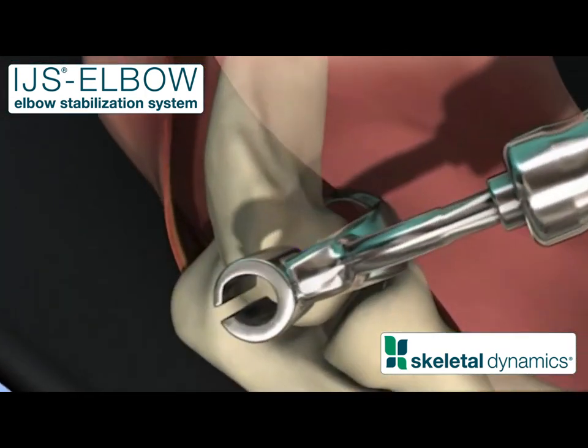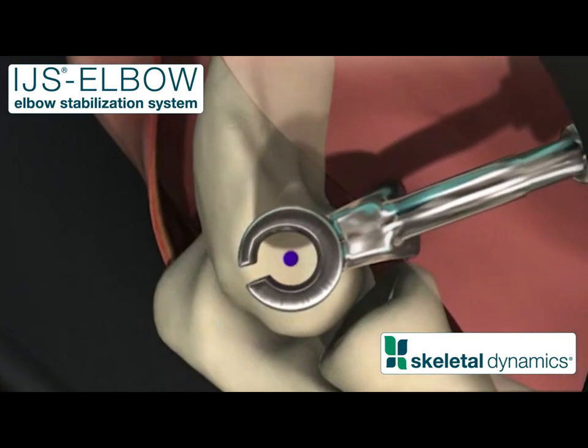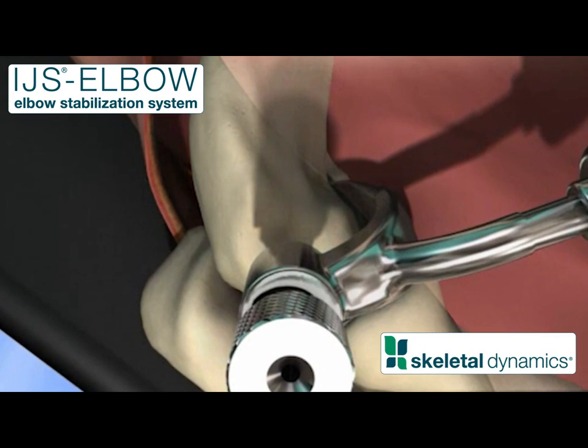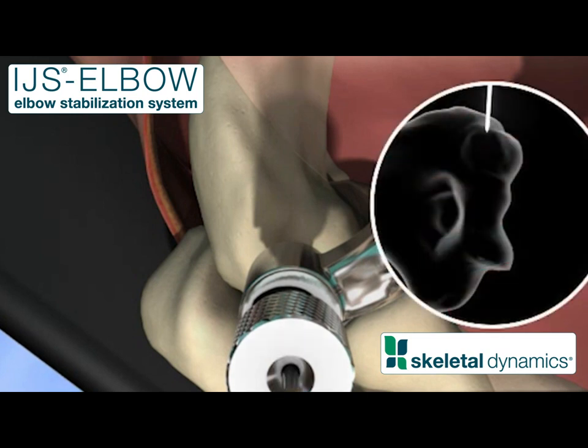Position the distal end of the axis trajectory guide around the trochlea. Insert the aiming pin through the trajectory guide, providing a direct path to the previously marked center of the capitellum. Using fluoroscopy, advance a 1.5 millimeter K-wire through the aiming pin into the humerus.